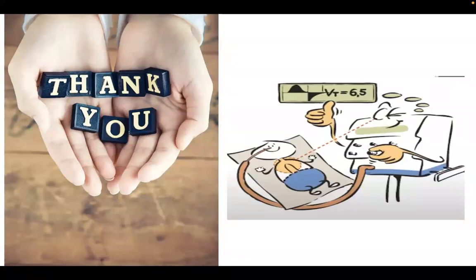Regarding volume guarantee and volume targeted that he's asking, sir, what I have found in one review is that volume guarantee is a type of volume targeted ventilation where they use the exhaled VT. They particularly highlighted the term exhaled VT because even inhaled VT is measured in some ventilators. Exhaled tidal volume is assumed to be the tidal volume which has reached the alveoli, but that is also not correct. Some amount of volume will be lost during the expiratory phase also.